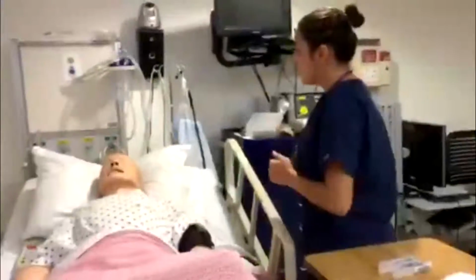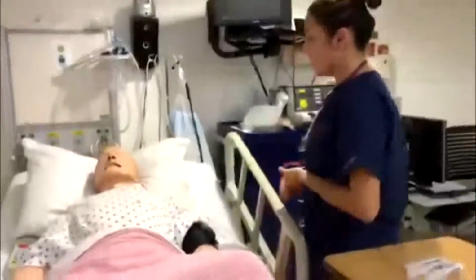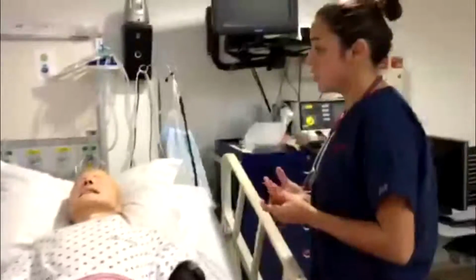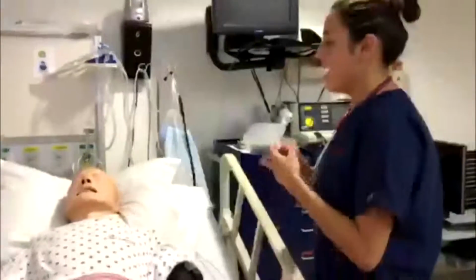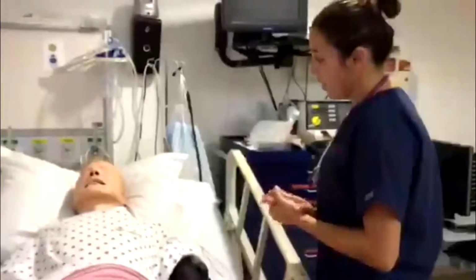Okay, so Zosyn is actually an antibiotic that's going to help treat your pneumonia. And so we'll be infusing it slowly because you do have hypertension. We want to make sure not to overload you with fluid and cause your blood pressure to go up. So that's why we'll be infusing it slowly, okay?